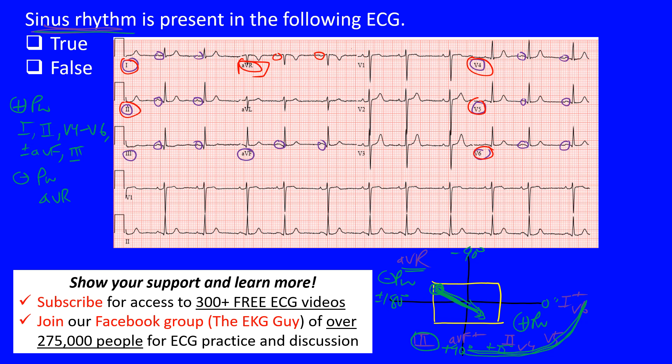That covers the morphology, but that's not all. You must also confirm that P waves precede the QRS complexes — one P wave for every QRS complex. Additionally, in sinus rhythm you typically see a regular rhythm where the R-to-R intervals are consistent throughout.